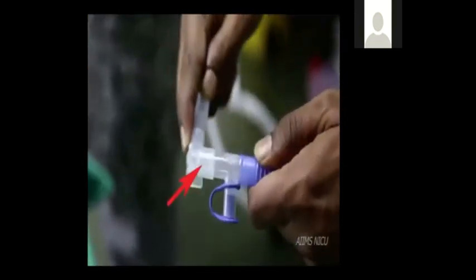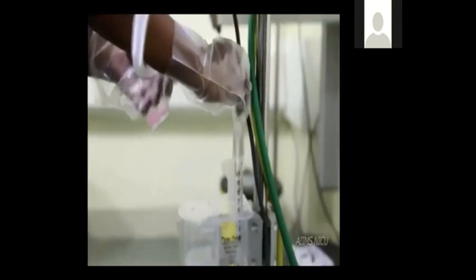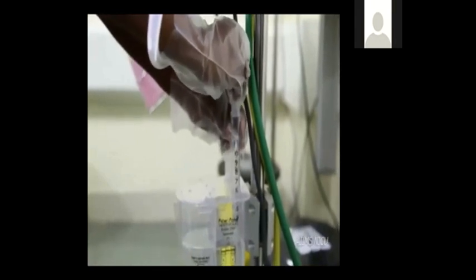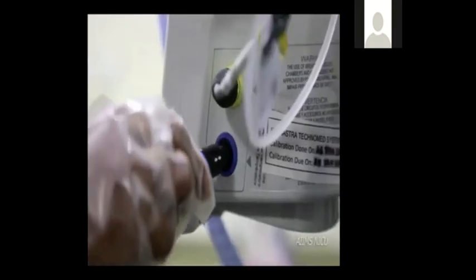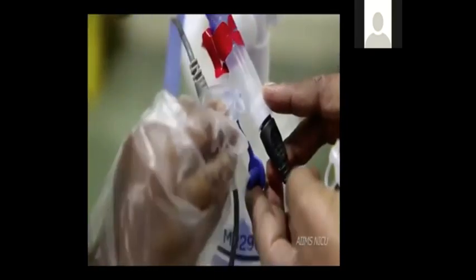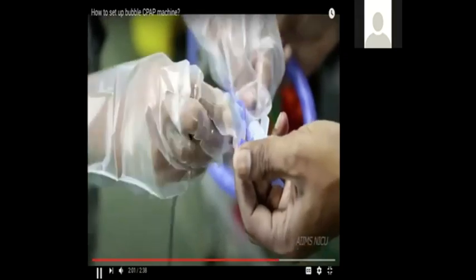To the other end of the blue inspiratory limb, lock the white expiratory limb of the bubble CPAP circuit. The second end of the expiratory limb is connected to the bubble chamber. Fix the heater wire and the temperature probe to the appropriate slots available in the humidifier and the inspiratory limb of the bubble CPAP circuit.